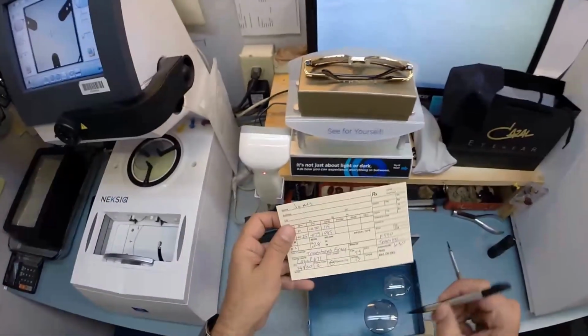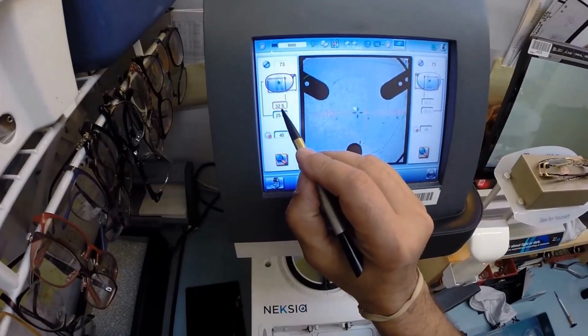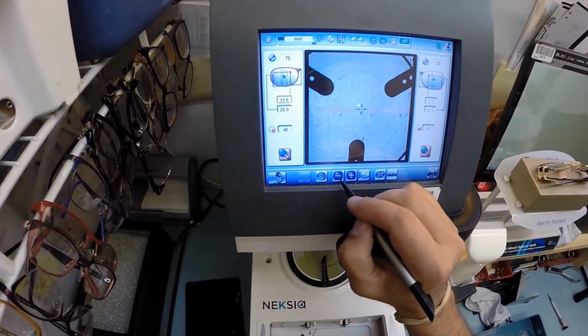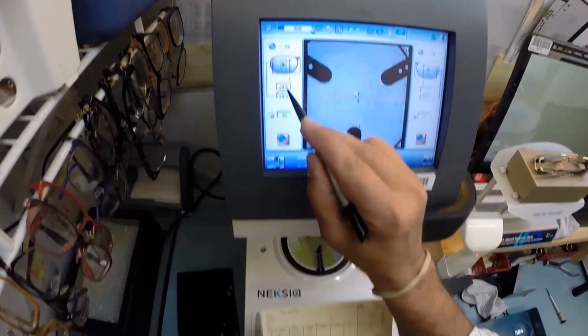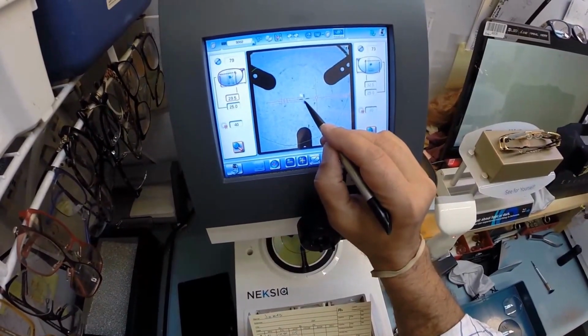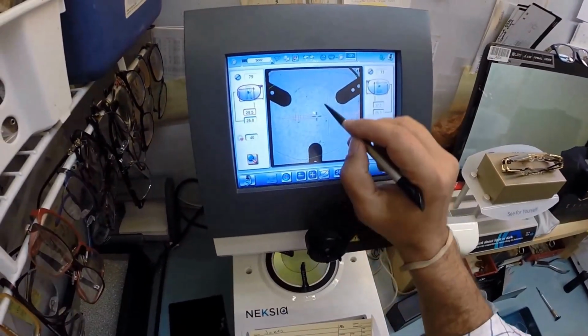Let's see. Your pupillary distance for your right eye is 29.5. The computer starts at 32.5. So I'm going to tap this minus button and keep going down in 0.5 millimeter increments until we get to 29.5. The middle of this blue cross is the geometric center of your frame, but your eye is going to sit above that.